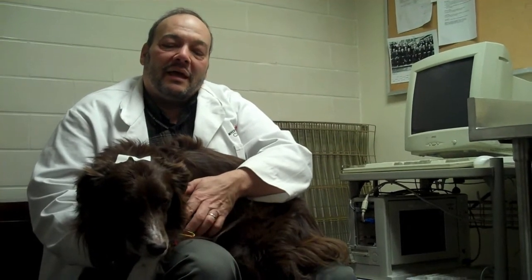The first thing we have to do is put some lidocaine on the three sites where the electrodes are going to go, and that will deaden the area out. We take her head size, so we know what affects the size of each dog's head — a Chihuahua is different than a Golden Retriever on the test.